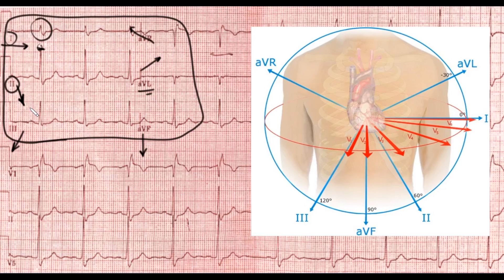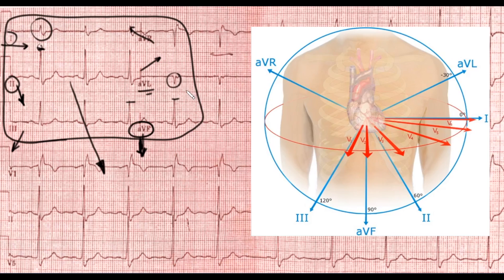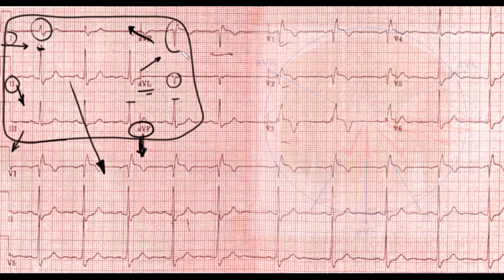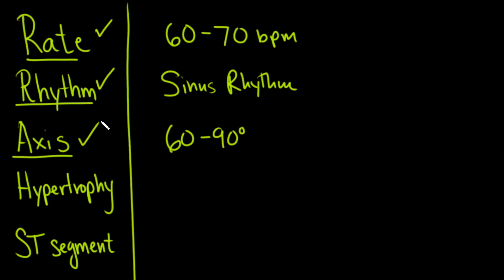So the axis is going in this direction — almost parallel to lead II. If that's the case, it should be positive in lead III because it's going almost in the same direction, and that's the case. Since it's going almost parallel to AVF, it should also be positive, and it is. Because it's going almost in the opposite direction to AVL, it should be negative, and it is. Compared to AVR it should be the most negative, and that's where you have the biggest negative discharge. So the overall axis is somewhere between 60 and 90 degrees.